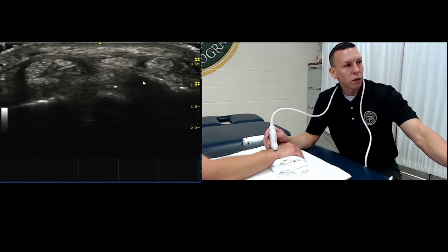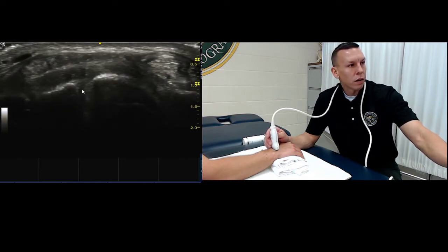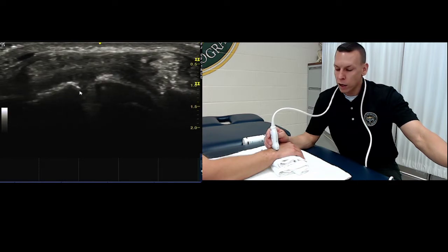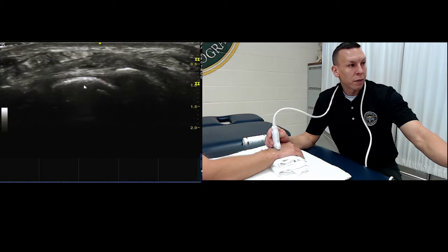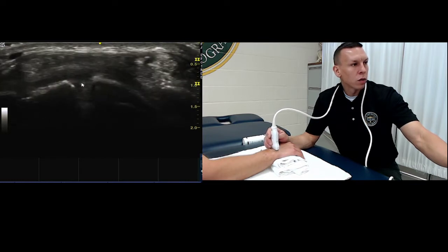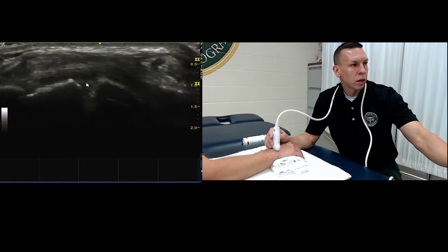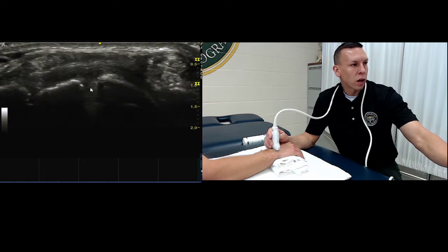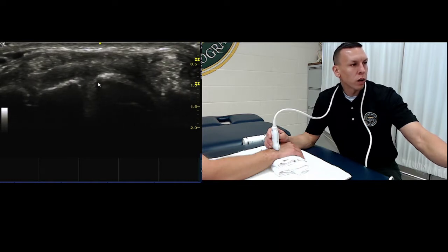So here we've seen the radius has dropped off, and we're looking for two bones down here. And right there they are. Watch if I slide just a little bit more, the lunate went away, and now we're at the capitate. And so, here's some connective tissue over top of it, but we're looking for this structure right here, and you might need to turn your probe a little bit. It looks almost like a wedge or triangle. And what we're looking for is this interval.